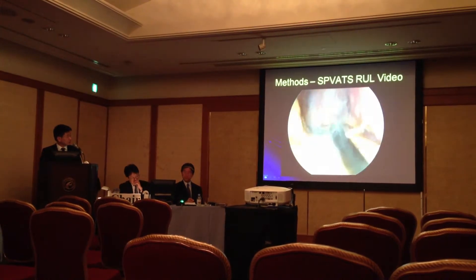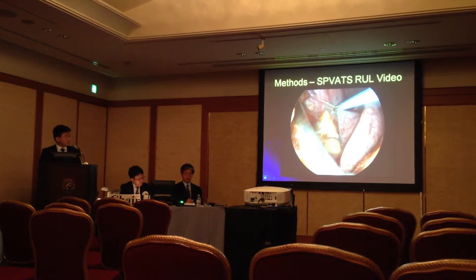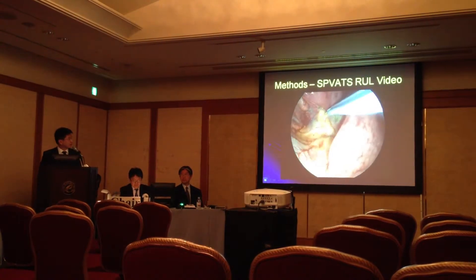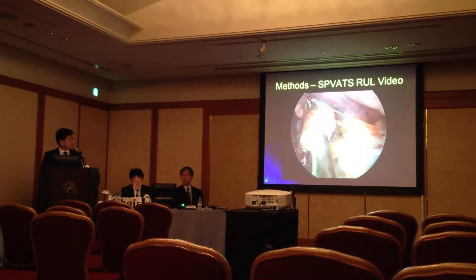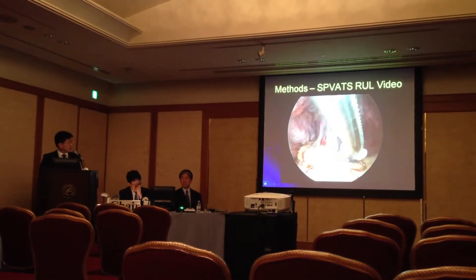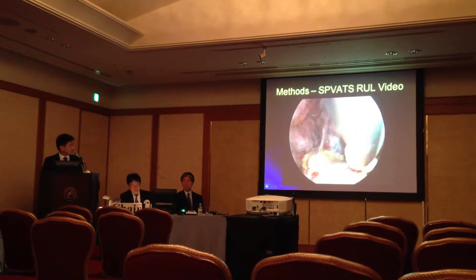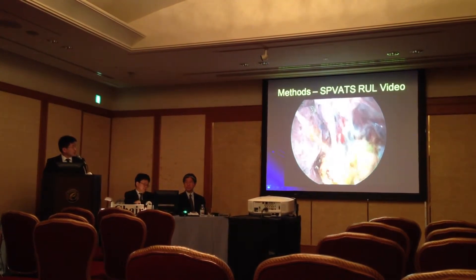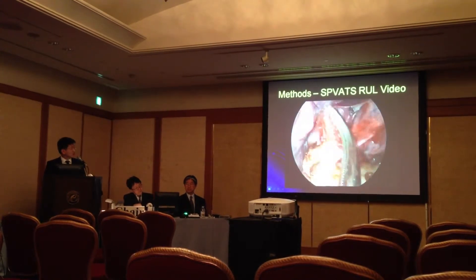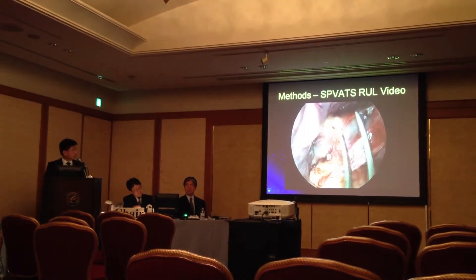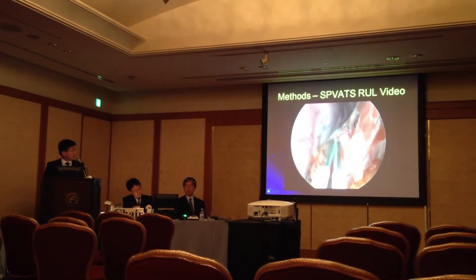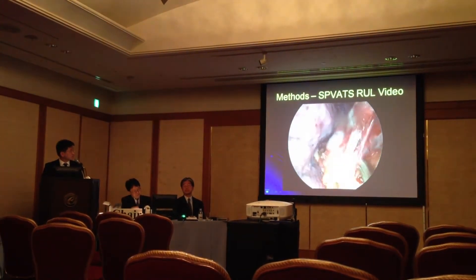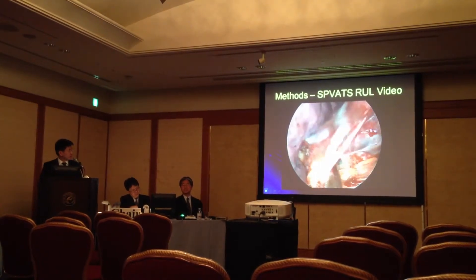We use the Storz endo-curve instrument to free the inferior pulmonary ligament. This specific case has a nice fissure, so the upper lobe is falling out with a complete horizontal fissure. We're dissecting the hilum, using a peanut or dental pledget for blunt dissection, and freeing up the right upper lobe pulmonary vein. Because the surgeon is looking through the camera anteriorly in single-port, it somewhat mimics open surgery, so it's quite easy to learn. We then go around with a right-angled instrument.